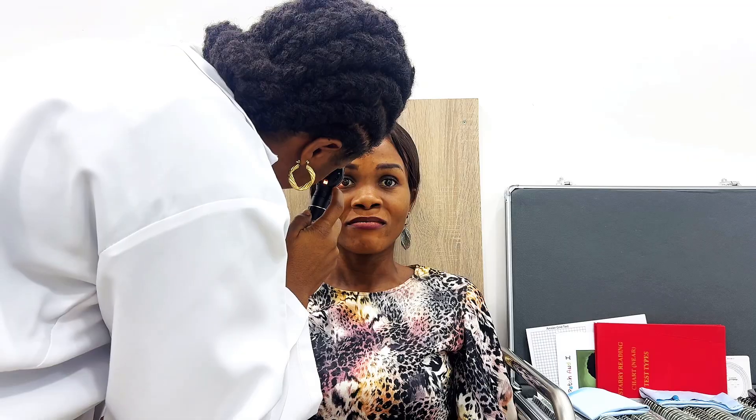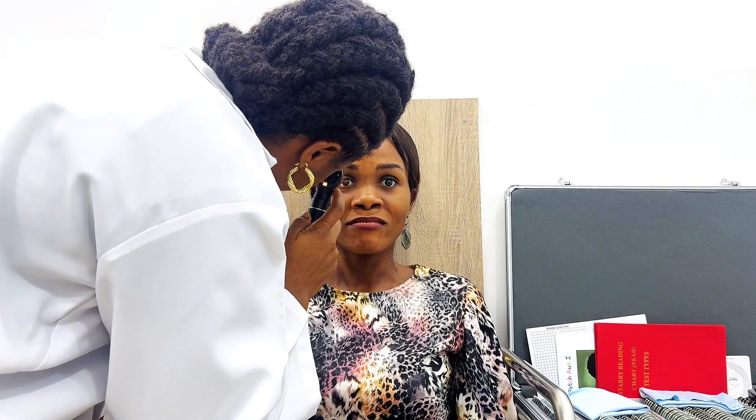Hold the ophthalmoscope in your right hand to examine your patient's right eye — right hand, right eye. I have seen people who want to examine the patient's left eye using their right eye with their right hand. That's not going to work. The next thing you need to ensure is that your ophthalmoscope is tilted about 20 degrees away from the patient. This is to avoid your nose bumping into your patient's nose.